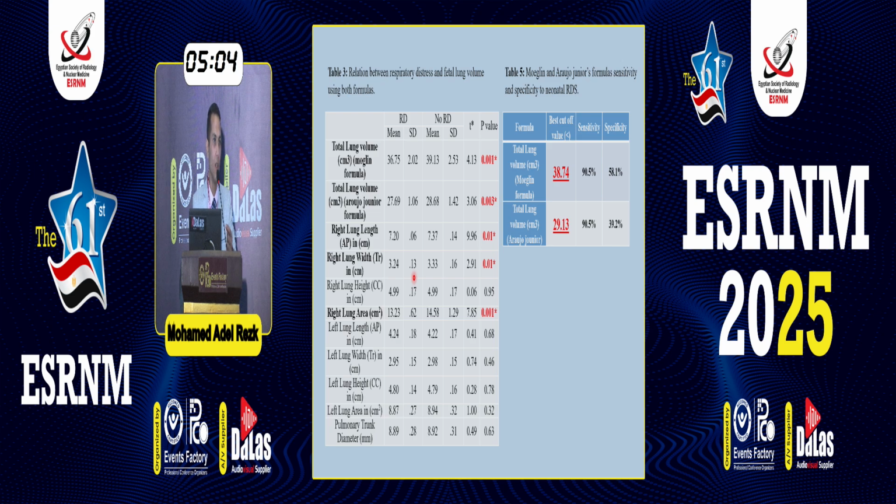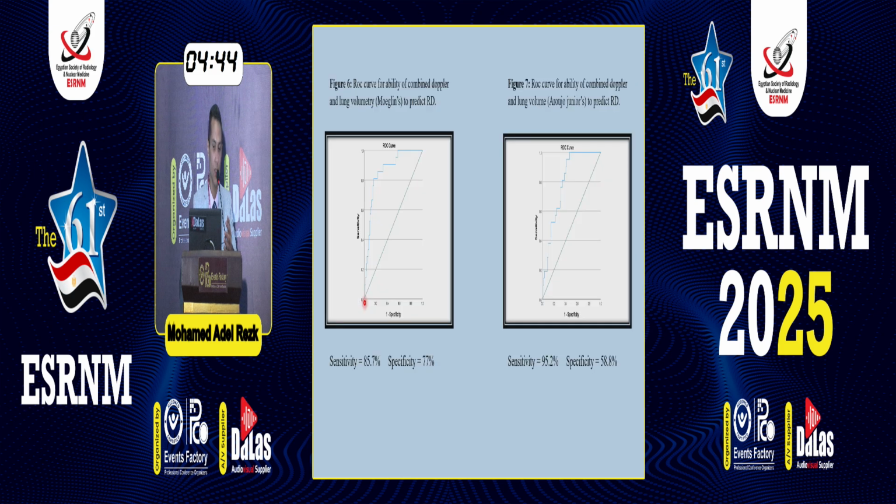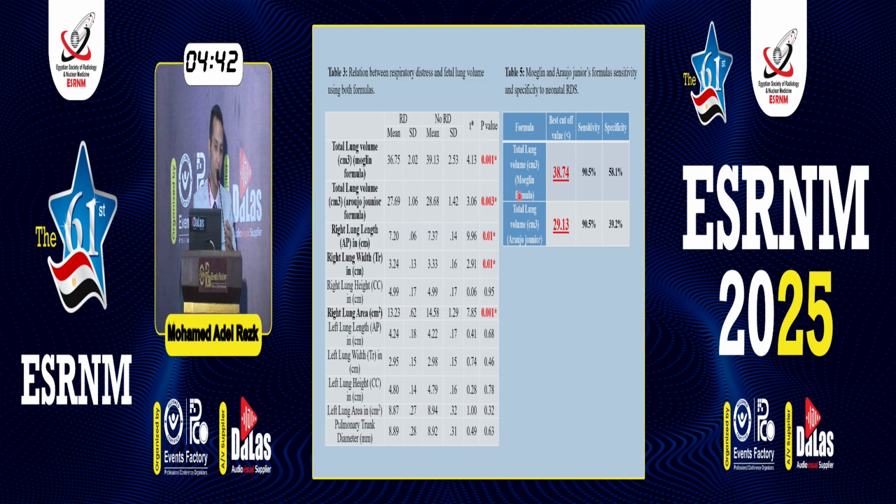For the fetal lung volume measurements using the 2D formulas, the Moglen and the Arujo Jr. were both significantly correlated to the fetal respiratory distress. What we remarked is that the fetal lung length, the AP diameter, the width, and the area also individually showed significant correlations to the progression of fetal respiratory distress. And here are the cut-off volumes using each formula.